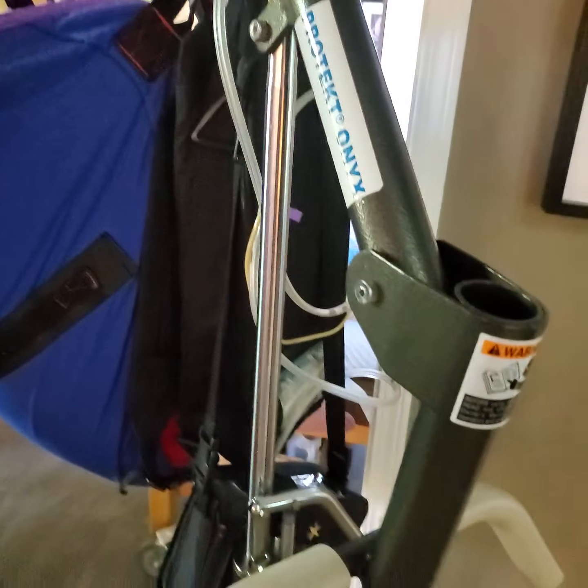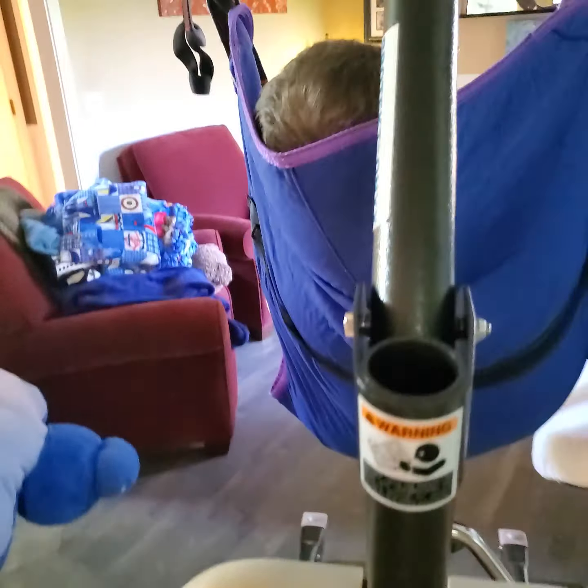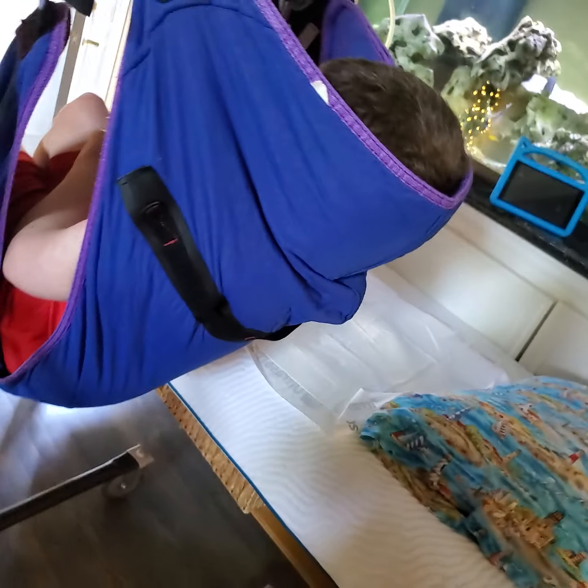Now Jack also moved a little bit, so you can take these handles on the back and straighten him out so that he's in alignment with the feet below. And then you are going to push the lift over to the treatment table and center the legs under the treatment table. As you can see, fish tank there. And then you're going to take this handle and straighten Jack out so he's in alignment with the bed.